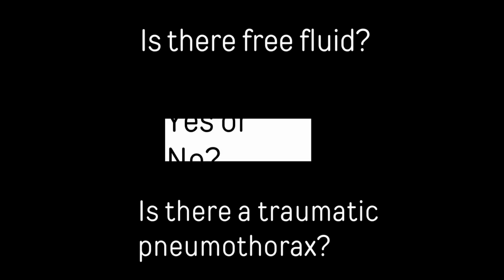Okay, so EFAST. It is a binary question of is there free fluid, yes or no? Is there traumatic pneumothorax or hemothorax? And then the question is, can you quantify? From a level 1 point of view, we're just asking a binary question. Is there free fluid, yes or no? But as you scan more patients, you can have a very good idea about whether this is where the bleeding is coming from. Oftentimes we have a trauma patient and there is free fluid, but it is minimal. I need to really hunt for it. It is there, but this is then not the cause of the shock.